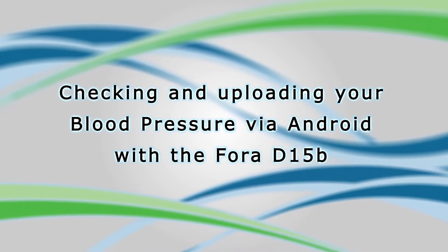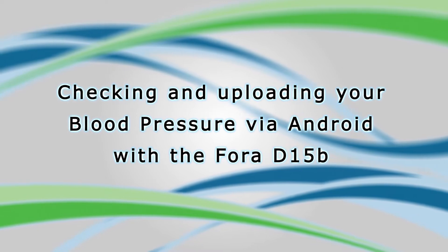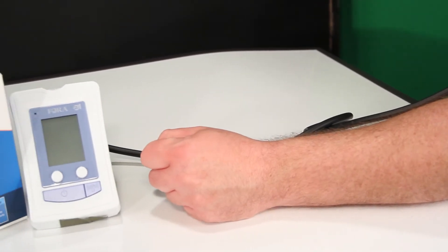Checking and uploading your blood pressure via Android with the 4D15B. Take your blood pressure using the armband.